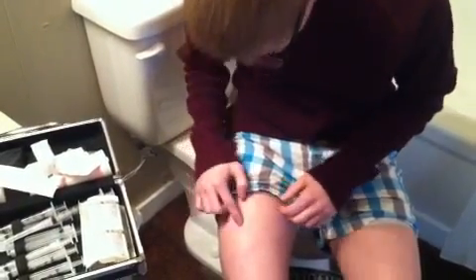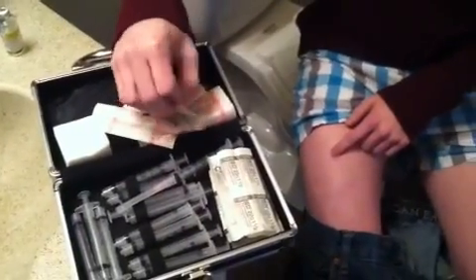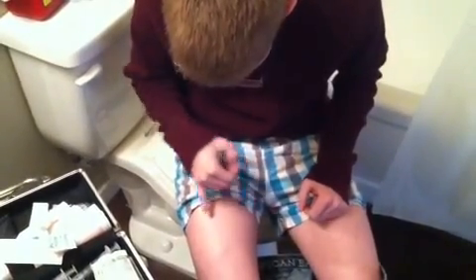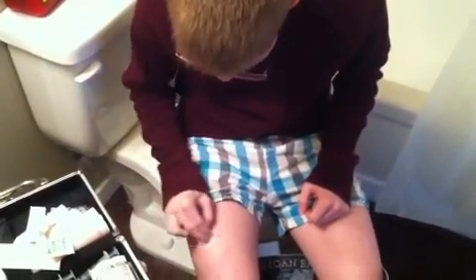Right there. Yeah. So once you get a spot picked out, you want to make sure, like, luckily I'm wide enough that I can kind of see the veins in my legs, so I can go around them pretty easily. I can see I have a vein going right here, and it branches this way, so I'm going to inject right here, that way I don't hit it. So you want to get your alcohol swab. I usually just use the same one.